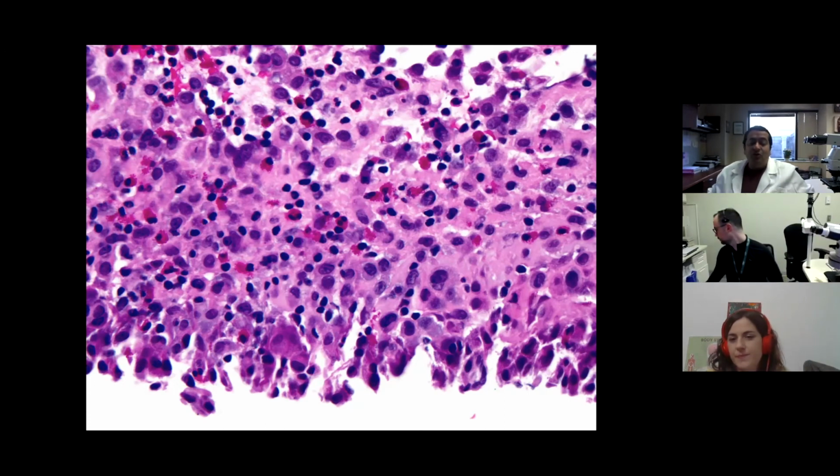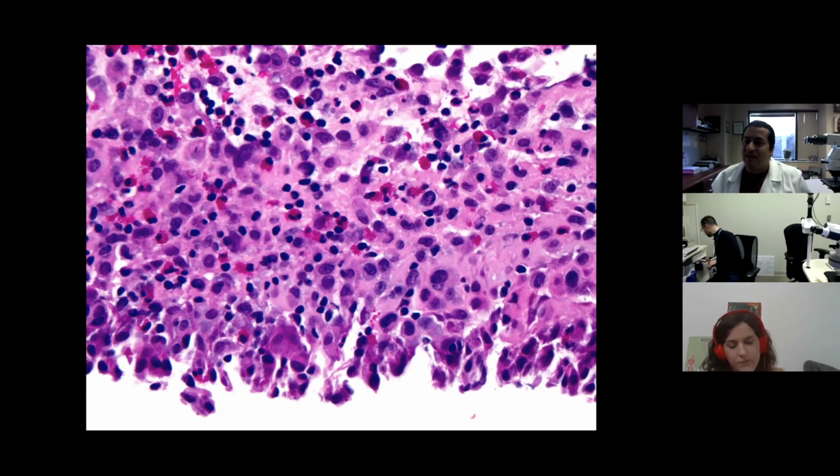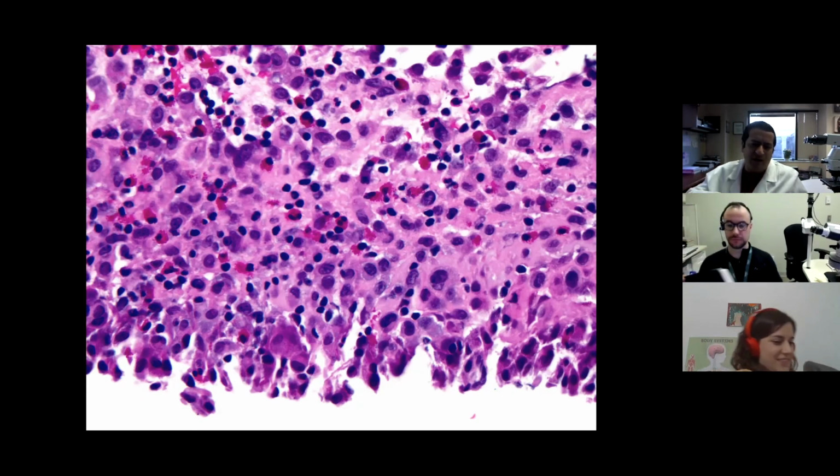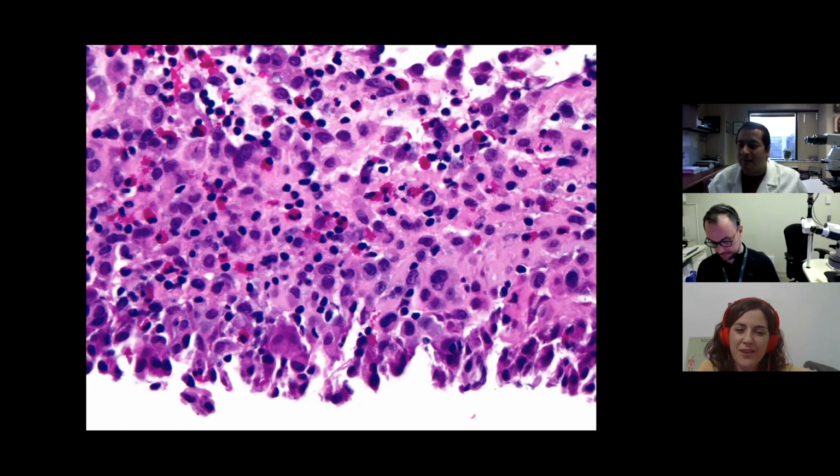So you guys bring up the differential diagnosis, which is Langerhans cell histiocytosis, but this is actually reactive eosinophilic pleuritis. It's just a reaction in the pleura to pneumothorax. Extremely common. Virtually every pneumothorax case has it. Yeah, I know what the clue is there, and of course I'm not showing you the whole case.